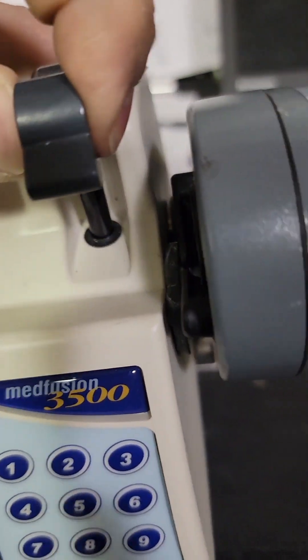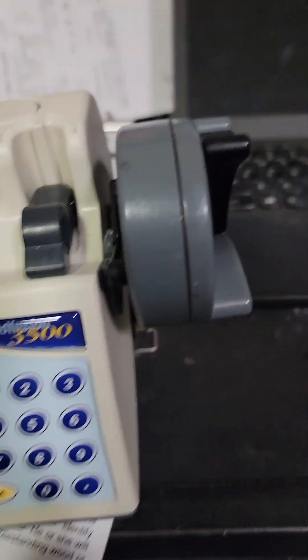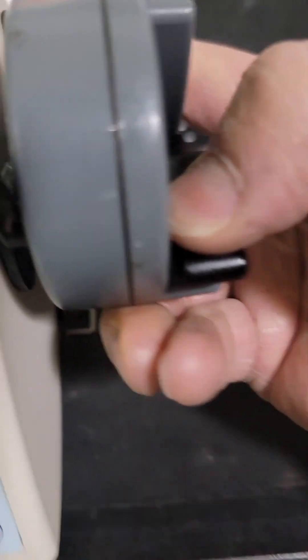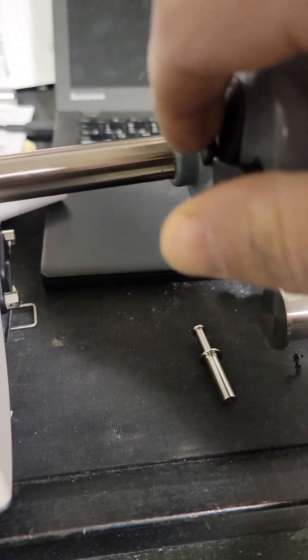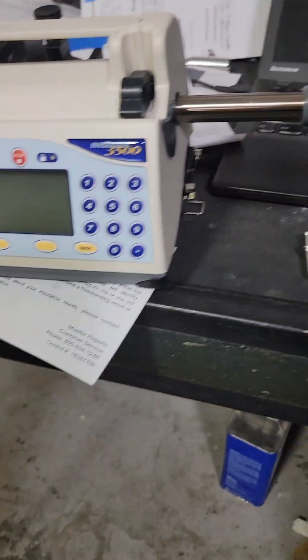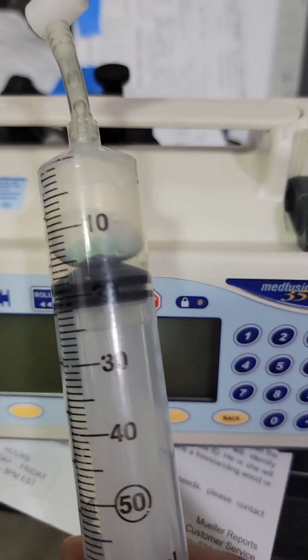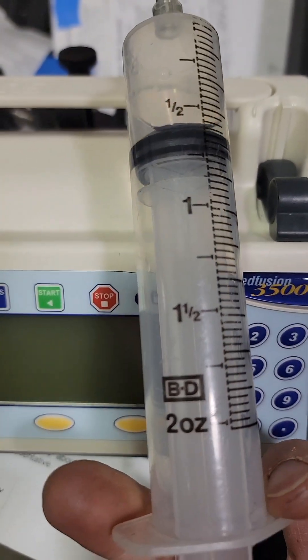So this is your barrel clamp. This is what tells the size of the barrel. This is your plunger sensor, right here. You plunge the back end of the syringe. Here is a 60 milliliter syringe from Becton Dickinson, aka BD.